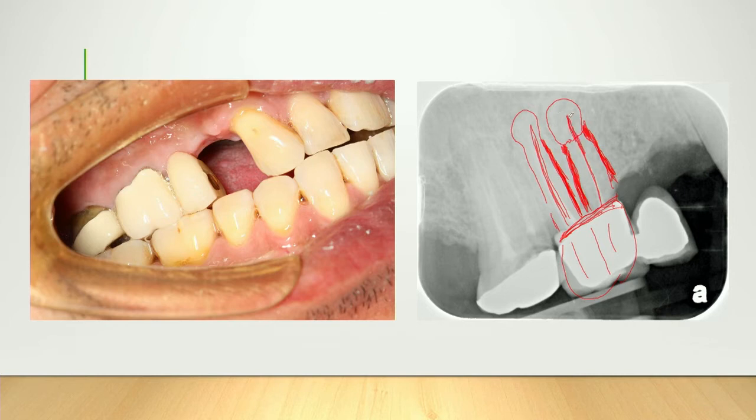And that's when you know alarm bells should ring. This is a bulbous root. Don't keep luxating because you'll fracture the bulbous root. You should keep drilling, remove interseptal bone, try and preserve the buccal bone, yeah?